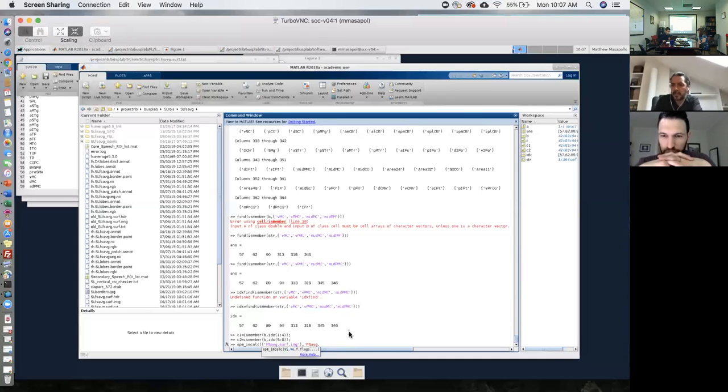What name should we give to this new ROI? What is a reasonable name for this new ROI that's going to be combining all of these individual ROIs? New comb ROI. What do these have in common? Well, precentral gyrus, but okay. It's like ventral and mid precentral gyrus, I guess. Right. Okay, I'm going to use precentral gyrus PCG as a general name, and then surf.img just to identify that this is still on the surface on this file.